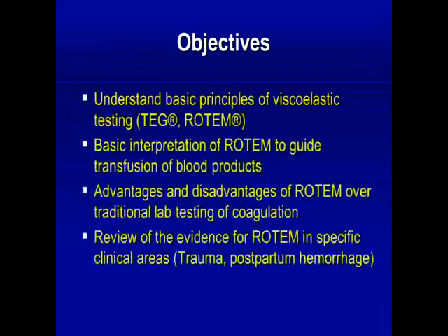The objectives of this talk are to understand the basics of viscoelastic testing, and there's a few brands out there. The main ones are TEG and Rotem. Those are proprietary brand names, but they are based on the same technologies. There's slight differences, but for the most part we can consider them to be the same.